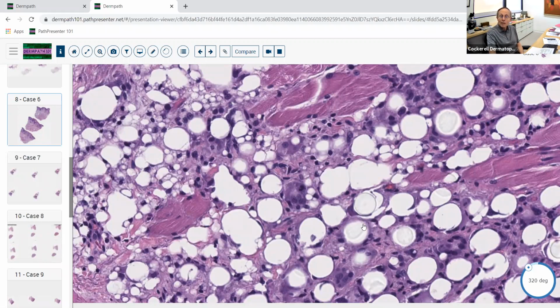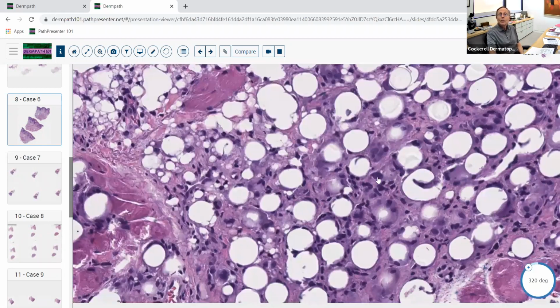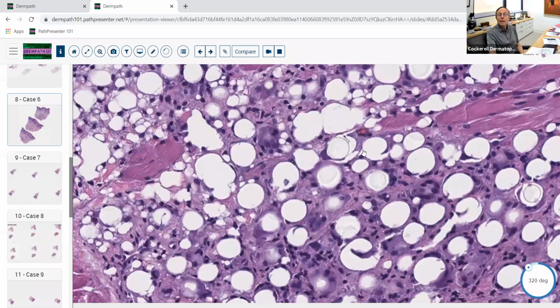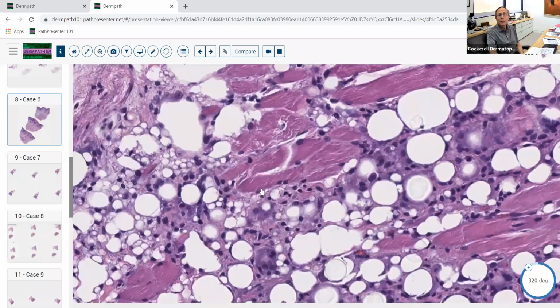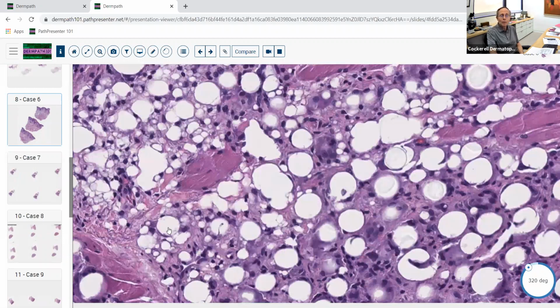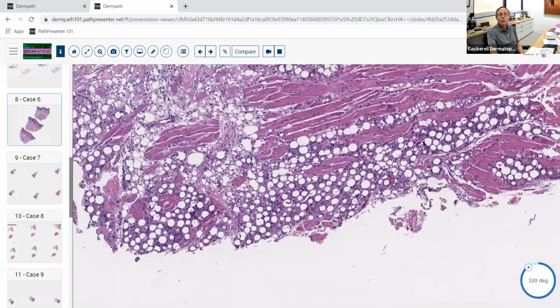These little BBs in the skin that are not blue and calcified would probably be methyl methacrylate coated little BBs. And some of those can have a lot of things inside the center. They can have collagen in there. They can have calcium hydroxyapatite. So depending on the filler, they can look kind of like these little BBs. So this looks like a combination of two different fillers. But notice it's mostly granulomatous. There's not a lot of suppuration here, but it did cause a granulomatous reaction.